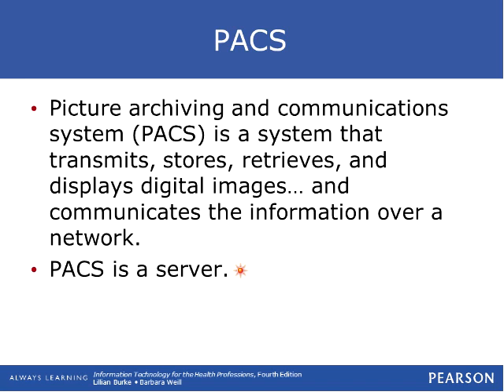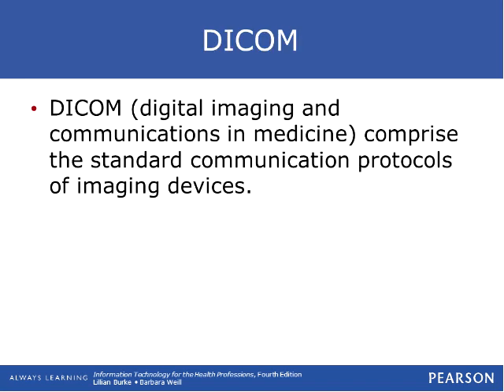So if a digital image is made and the radiologist sees something on the digital image, he or she can then make that available on the monitor to the provider who's providing that care, and they can discuss what's going on. It's literally an instant consult, and it provides a much clearer image. Imaging is fraught with all sorts of problems, but this improves those problems and makes it a much clearer image and much more optimal for the patient.